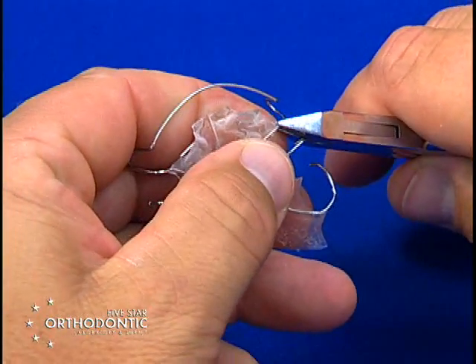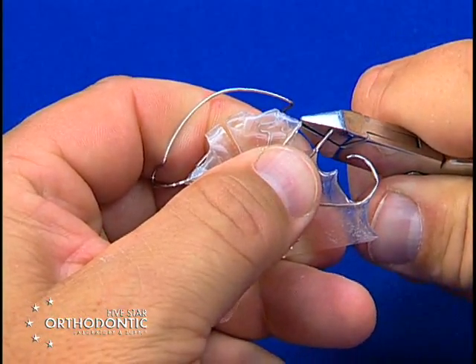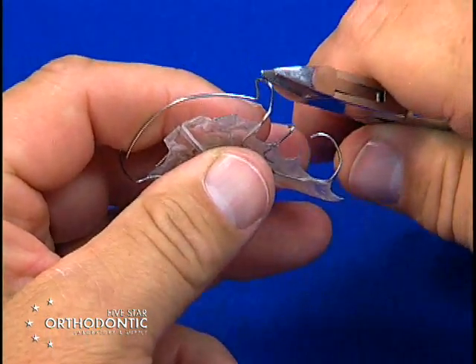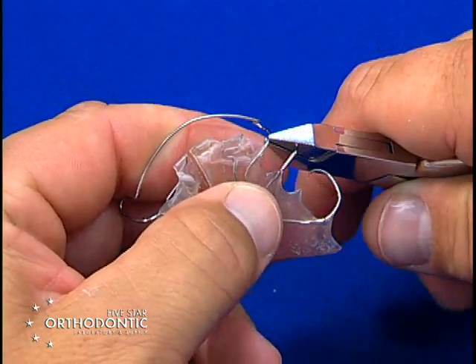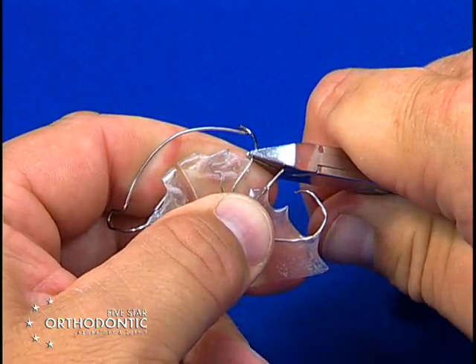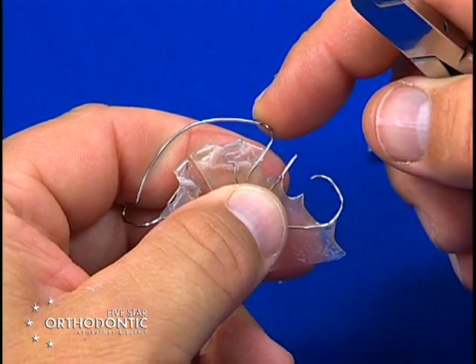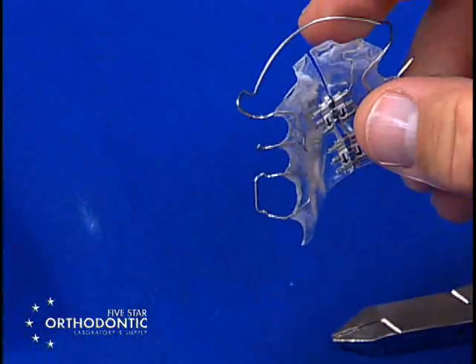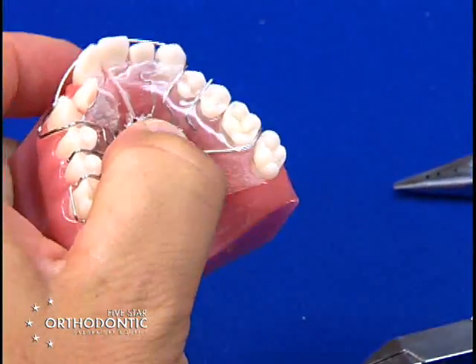Basically, you take the bow right next to the acrylic and turn the bow down toward the teeth — the top of the bow will come inward. You can then step out about another two millimeters and put a step-down bend, which will bring the top of the bow back out of contact and take the labial bow out of the occlusion into the proper position.